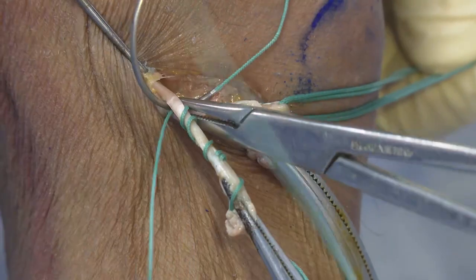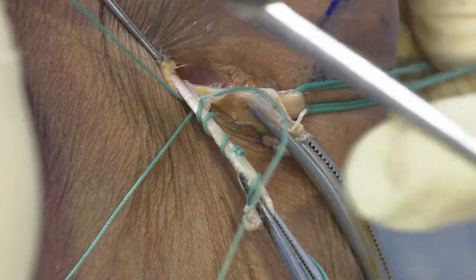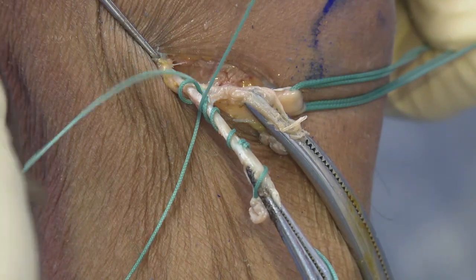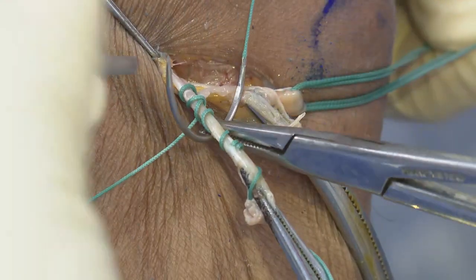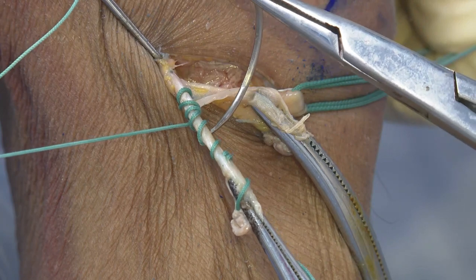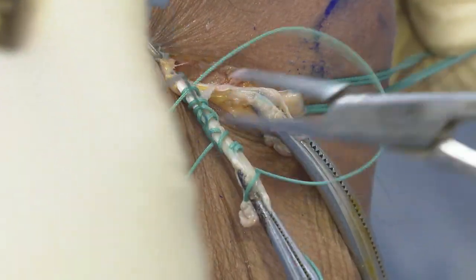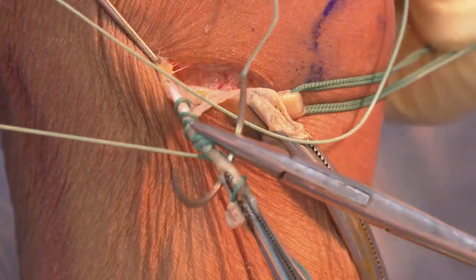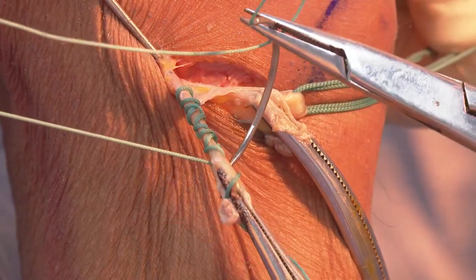Especially when the tendon is small. Okay, about 4 times and then you come back. So altogether four alternating sets, and then you go back. Okay, the good chance is you have less chance to cut into the suture. On the way back, be careful not to puncture the earlier suture. Yes, around. See. Also in alternate way. This way and then to the tendons. Okay. And then grab along like this. Okay. I make it faster that way. Okay, good. Okay, this is especially for the small tendon. You use this way, you have no chance of cutting through the tendon, even if it's a small tendon.